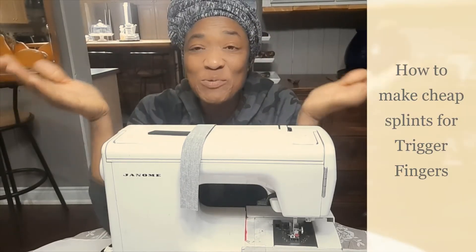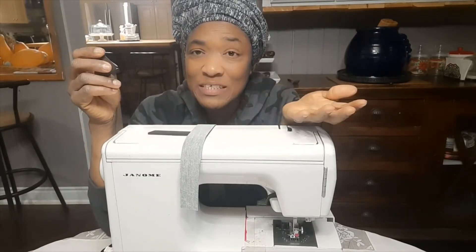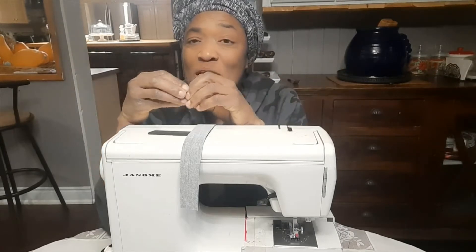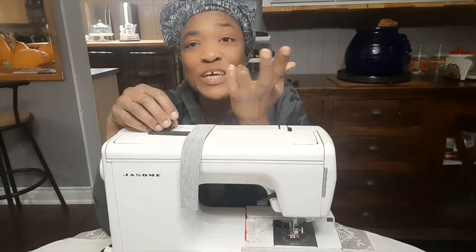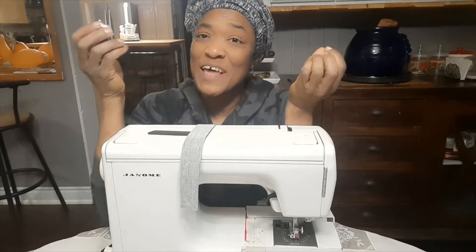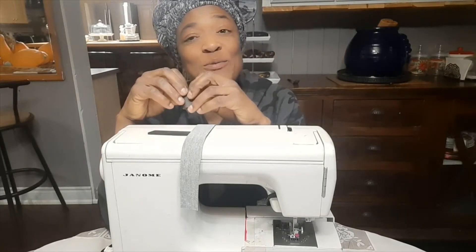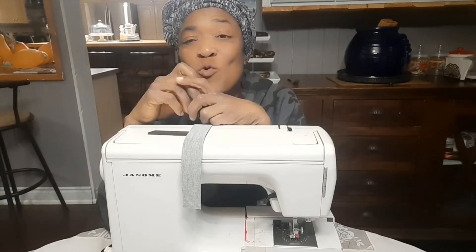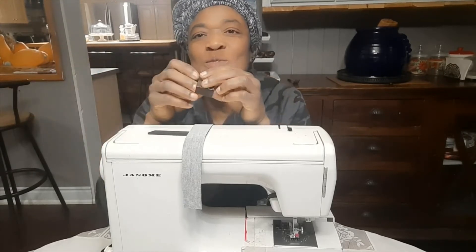Hi guys, I'm just here doing a little stitching for a family member. He has a trigger finger and bought a splint online to wear. However, when he's up and about during the daytime, it's not very easy to move his finger around, so he can't actually use his hand like he wants to use it. So I thought I could make him some splints that would be more flexible and he would be able to move his finger around and better use his hand.